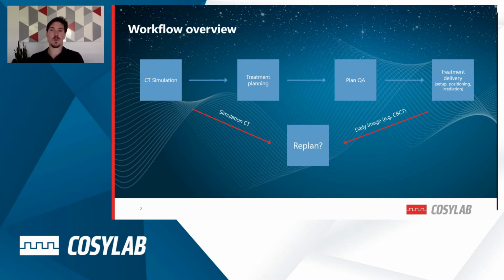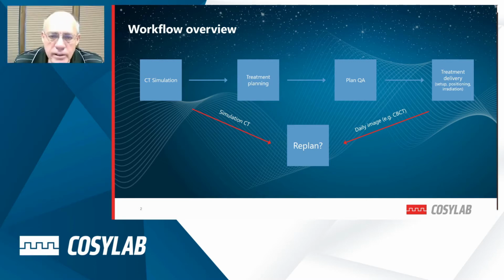Niek, if you could say a few words about plan adaptation, we'd really appreciate it. Yeah, I want to make sure that everybody understands that plan adaptation is a really important aspect of modern day radiation therapy, and more so in proton therapy. In the clinic, while I'm still involved at Provision Proton Therapy Center in Knoxville, we're adapting 17% of certain disease sites, and about 13% of all patients over the entire pool gets an adaptive plan.